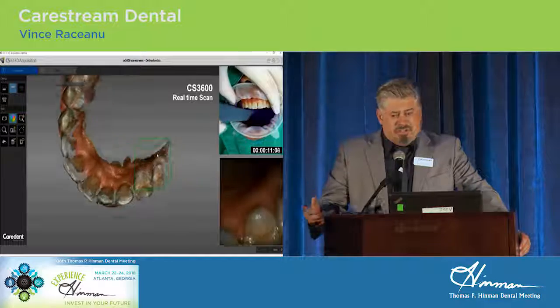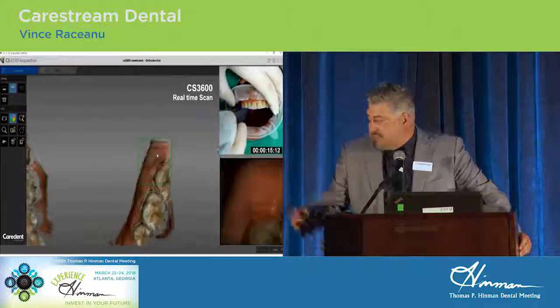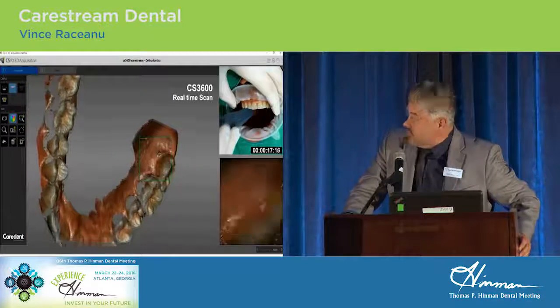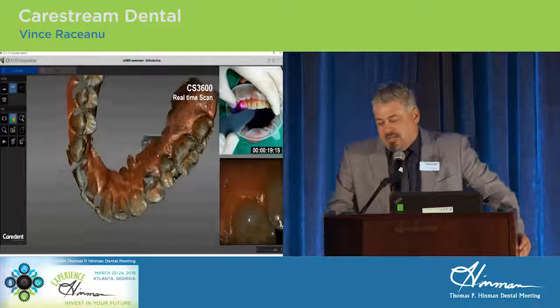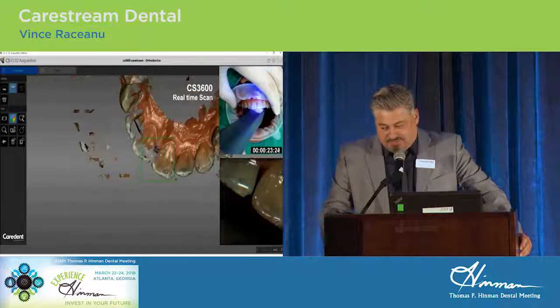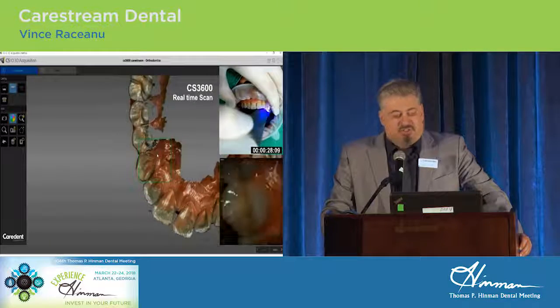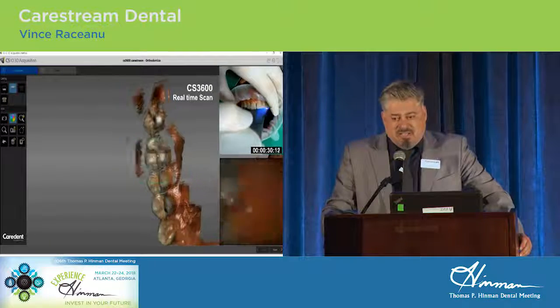I wanted to start with the video to really just give you an idea, seriously, about a live scan. You can see in the upper right how the scanner is being moved in the mouth. And just a real scan that you'll see, there's occasionally a little bit of lip or a cheek or tongue that gets caught in the scan. The software takes care of that on its own at the very end.